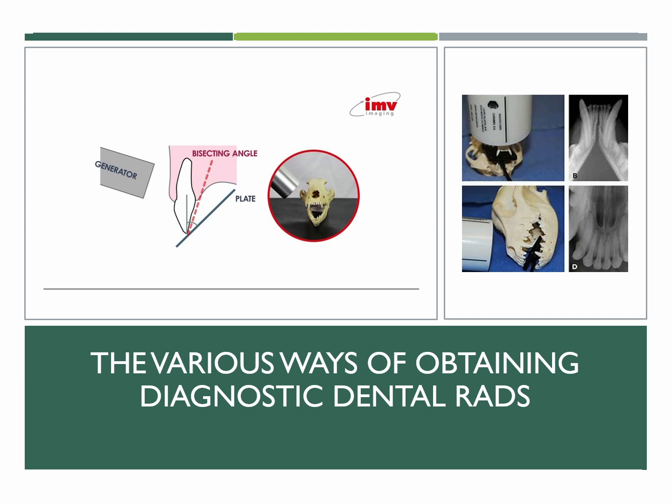Okay, now, like I said, you're going to realize that there are a lot of rules when it comes to taking teeth. It's not as simple as taking an abdomen where you measure here and take it in true lateral, making sure everything is perpendicular and parallel. A lot of teeth, you can't get that because you can't get the film perfectly behind.